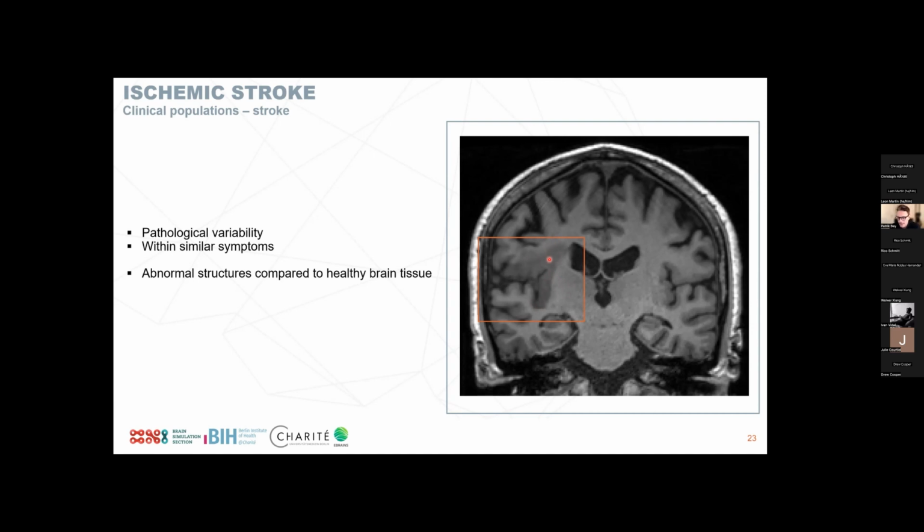So if we think about all of these volumes that we have as just 3D matrices or 4D matrices over time, and if we think about processing algorithms working on these matrices, we're now talking about just changes in the value at specific positions where there's usually a high intensity value, because we're talking about white matter. All of a sudden we have dark gray areas at the spot where there should be white matter. Right? So if we're thinking about, for example, looking for specific landmarks in the brain, those might be distorted, because we don't find a specific landmark there anymore because it's now shifted or distorted in terms of the intensity value.